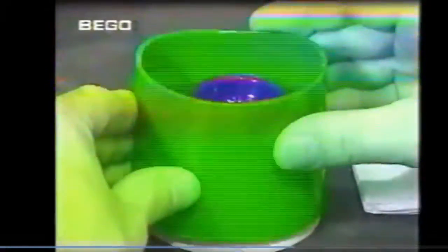Investment is now carried out without delay to enable the still moist Wiro paint fine investment to bond with the investment material. Otherwise, there's a danger of Wiro paint that has already dried not bonding with the investment material. Models with an investment material base no longer have to be secured by waxing onto the base plate.